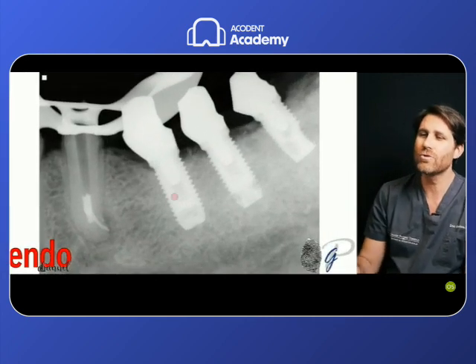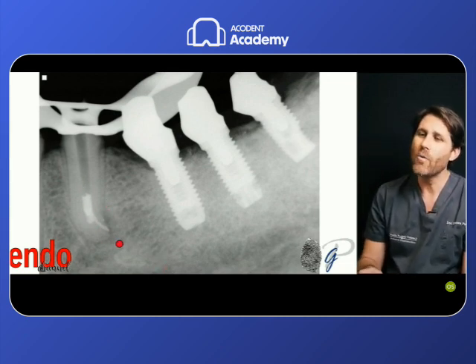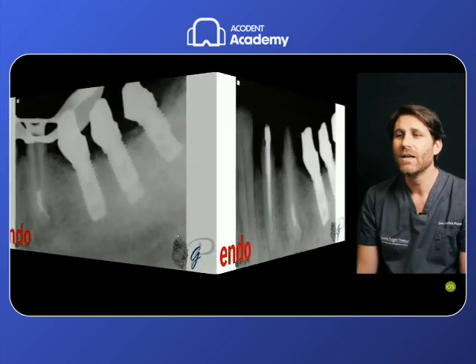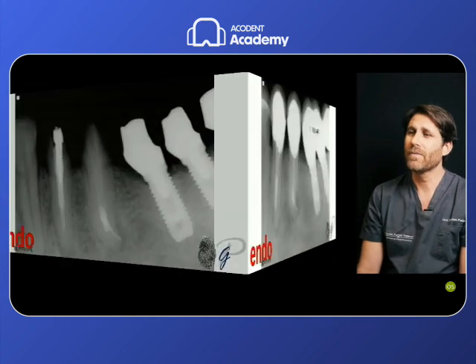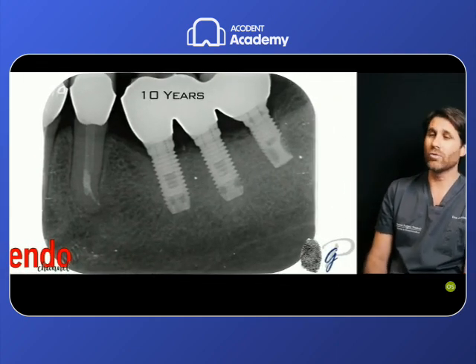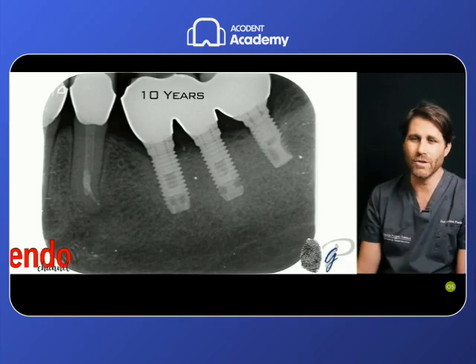And after the root canal filling, we can see the ledge and how we overcame the ledge and how we created a deep tapered preparation to perform then a three-dimensional filling to promote the healing, together with the mechanical preparation and irrigation. And this is the 1 year control and the 10 years control of this case with the complete healing of the periapical lesion.